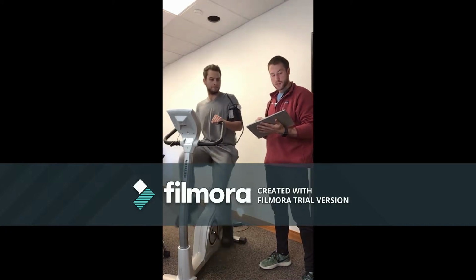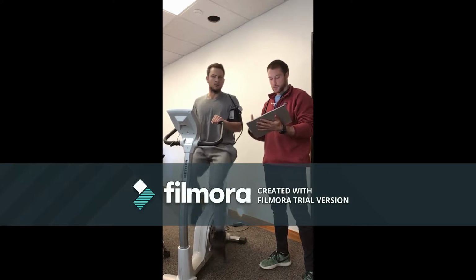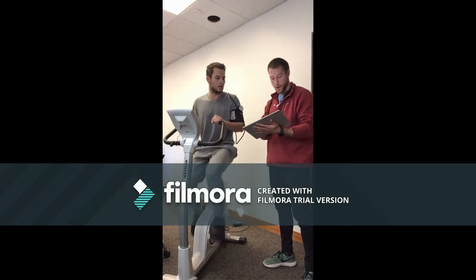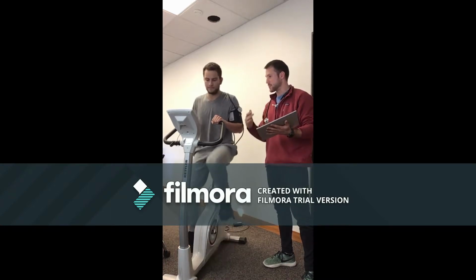There was no reason not to begin exercise, and you didn't have any symptoms like angina, mental confusion, pain at rest, cyanosis, nothing like that. So we were good to go. We have been monitoring how you've been adjusting to this increase in workload.